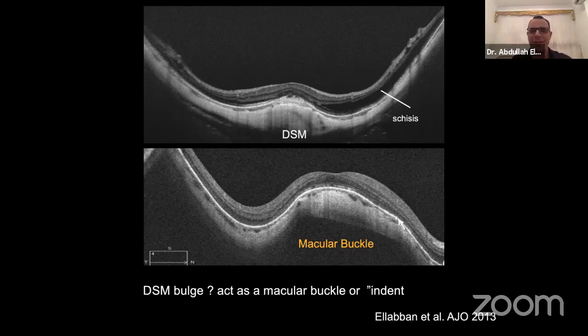Thank you very much for the question. Foveal lucency is actually a part of the normal closure of the macular hole. Normally what we see in macular holes, the inner layers of the hole close first, and then the outer retina closes next. So usually you see this hyporeflective space, which is what we call foveal lucency. And we studied that in relation to gases. So if you use SF6 or C2F6 or C3F8, would that be different or not?